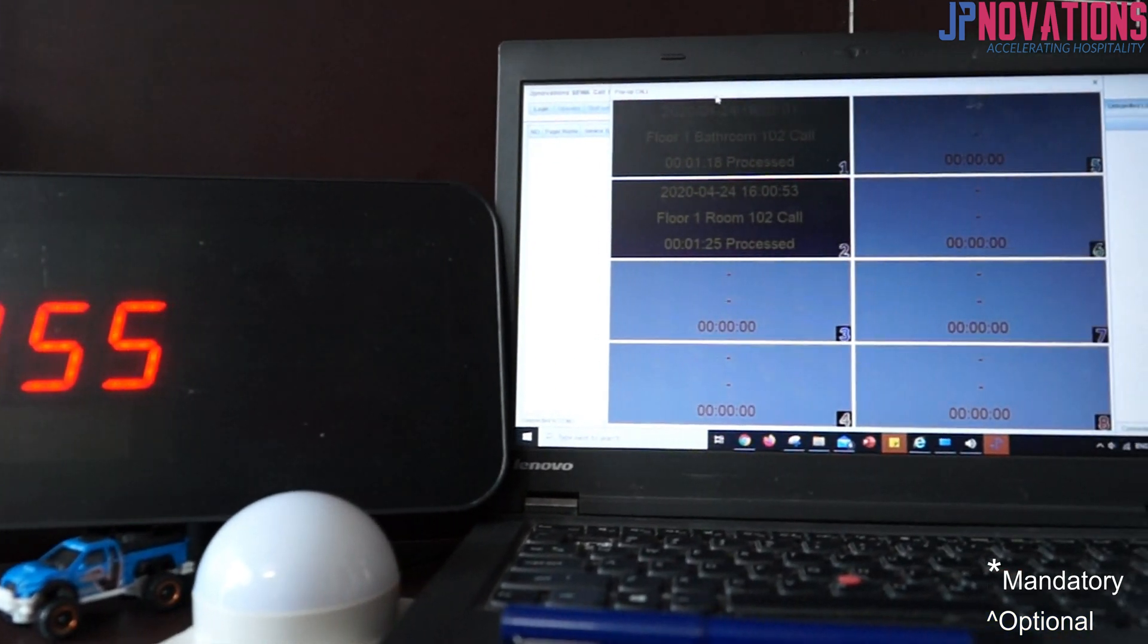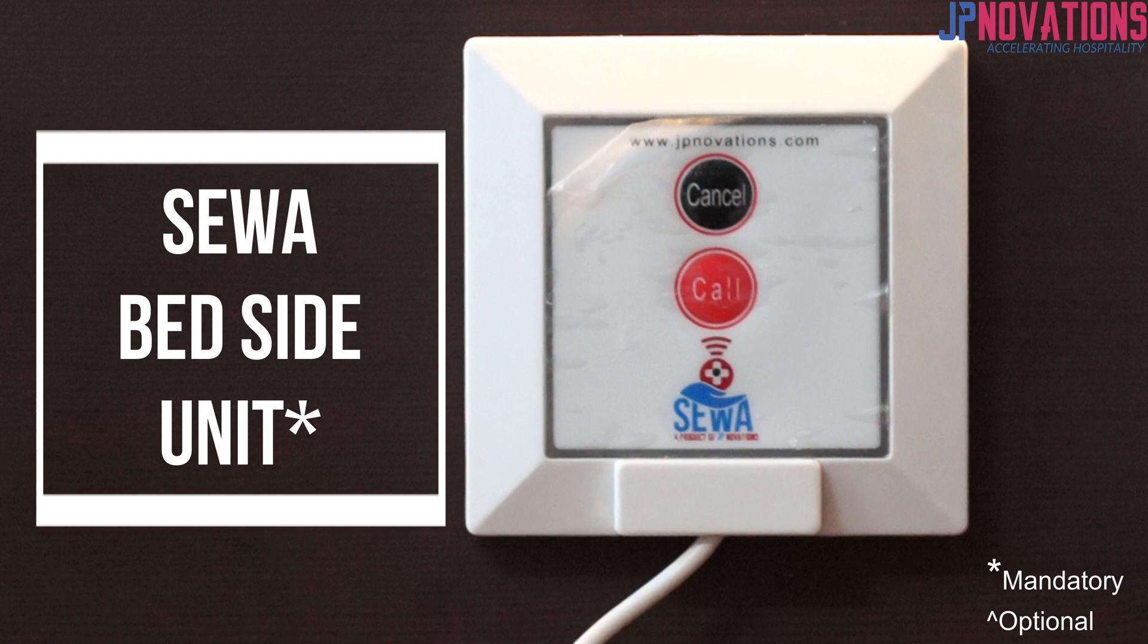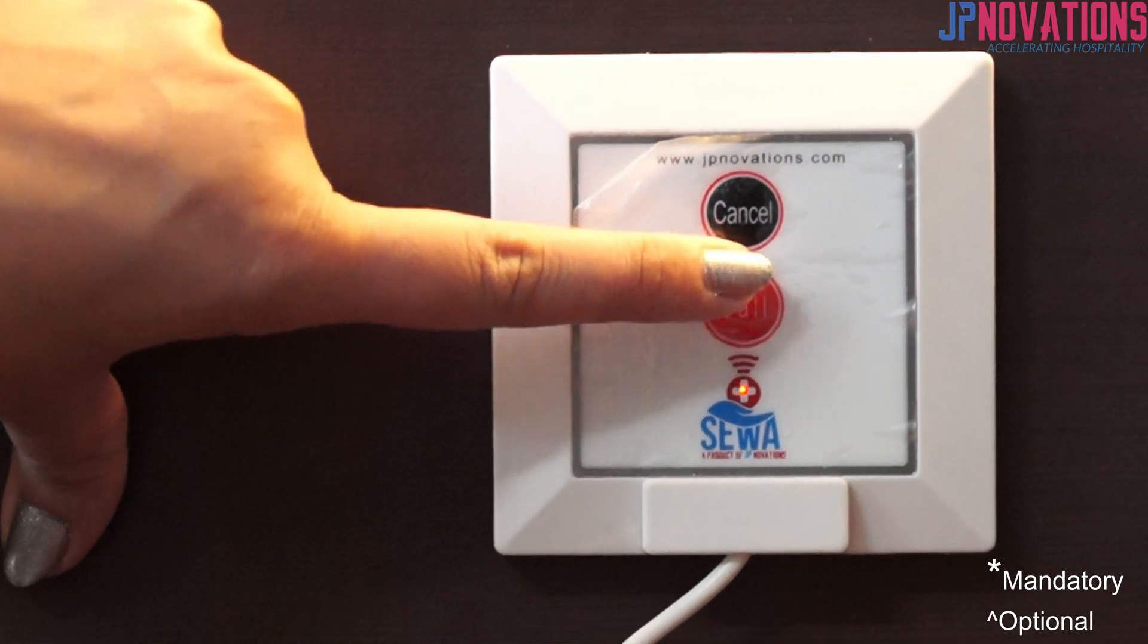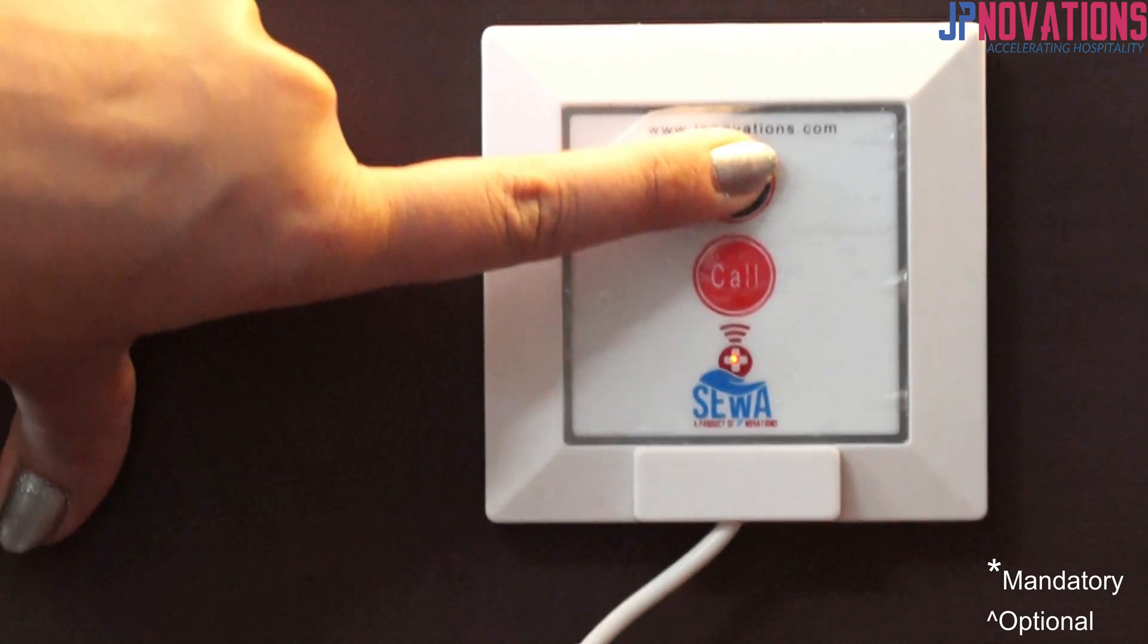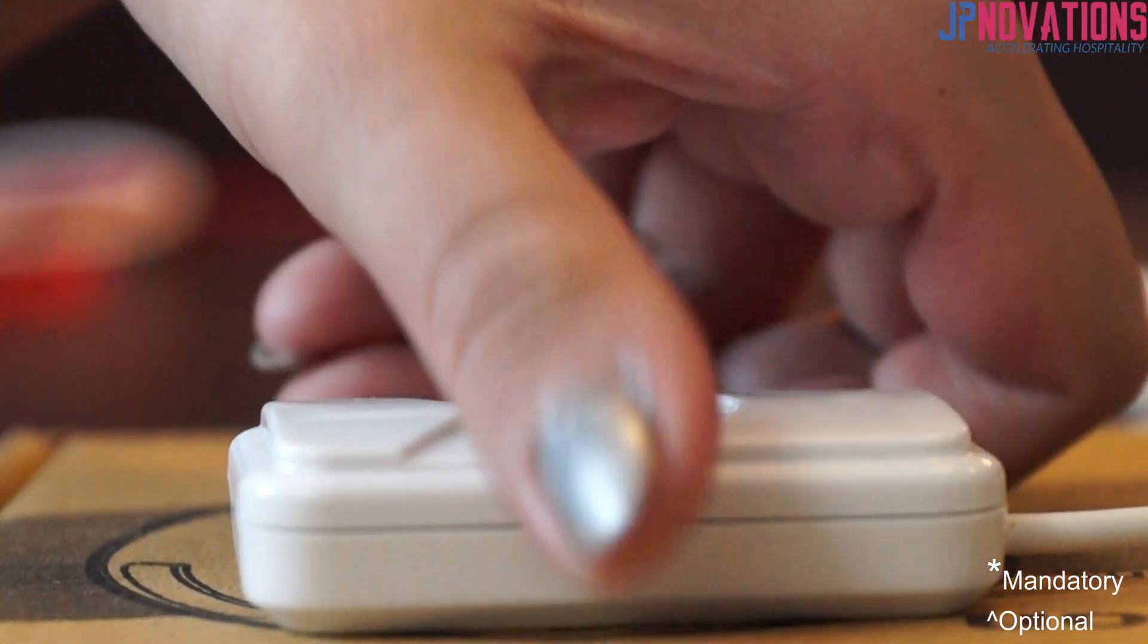First we start with the Sever bedside unit. Sever bed unit has two buttons: one to generate the call and a cancel button to mark the call has been attended. Also the unit is equipped with 1.2 meters of long flexible cord with a handy call button on the other end to ease the patient to call the nurse while laying down on the bed.